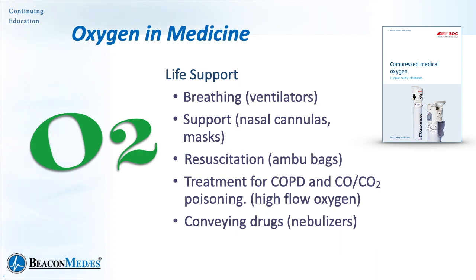Okay, oxygen, we pretty much know what that's all about. We have to have it to survive, we have to have it to breathe, so we're going to put it through ventilators. We're going to administer it to patients through nasal cannula and masks. That's typical of the pre-COVID, but also now with COVID we do it even more so, but in different ways. You can use it for resuscitation through things like an ambu bag or breathing bag.